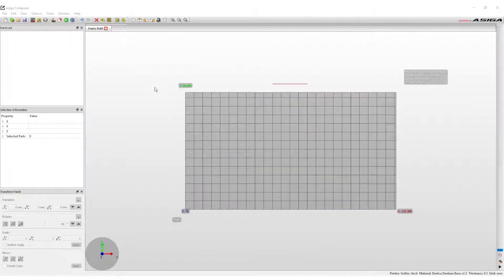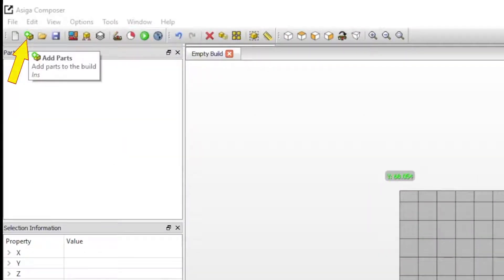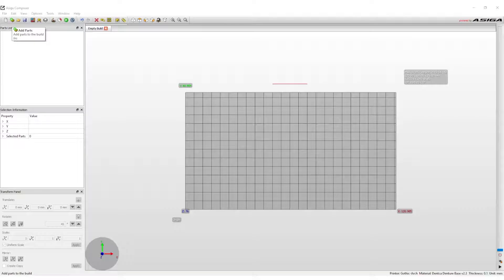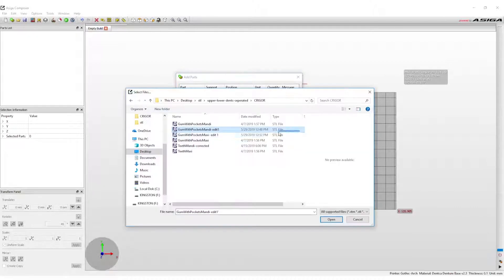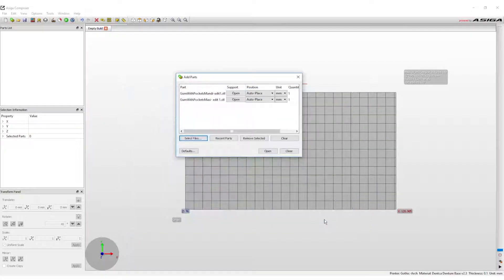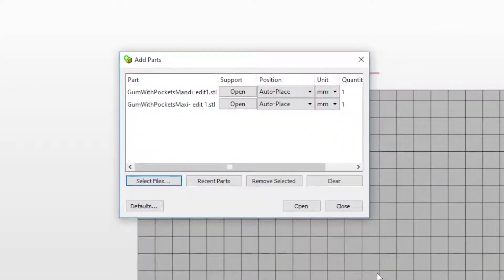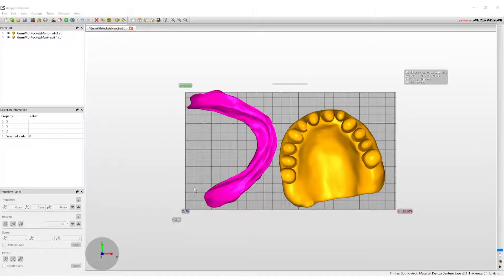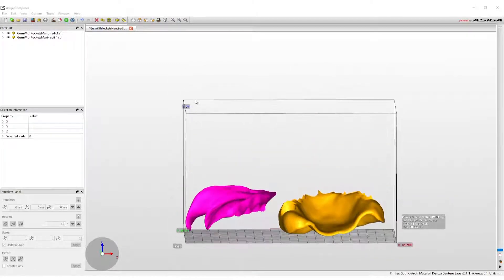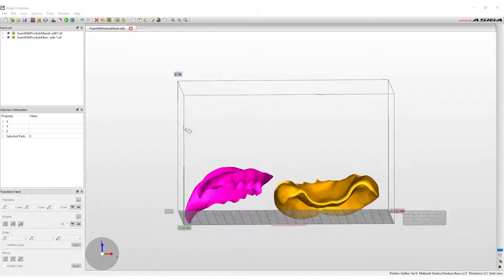There are two ways to import the STL files into the build: select the Add Parts button on the toolbar at the top, or right-click on the screen and select Add Parts. From the Add Parts window, press the Select Files button. Locate the denture bases files on the computer and select Open. More than one file can be selected at a time. Once all files have been selected, hit Open again to add the files to the build.